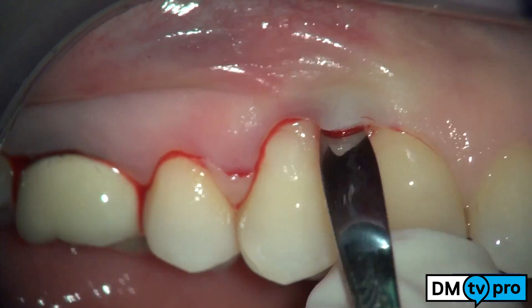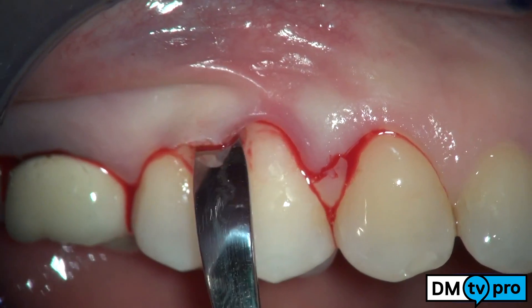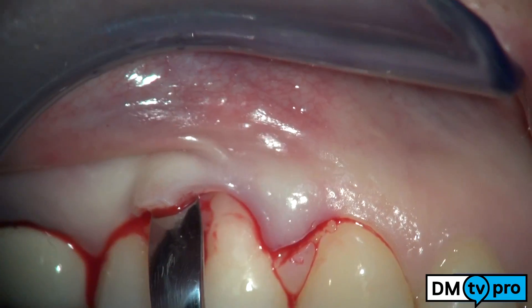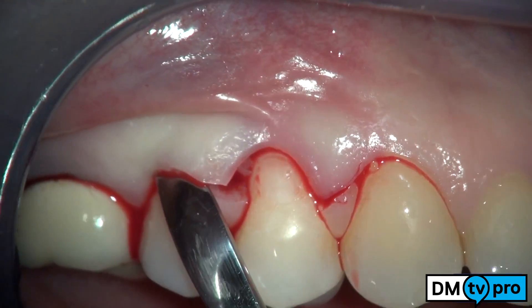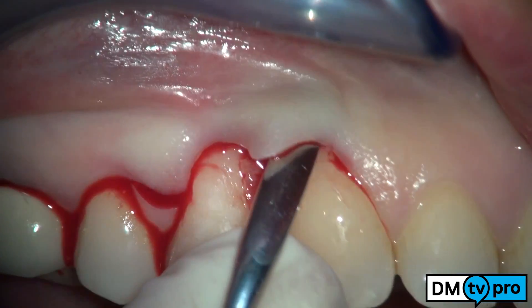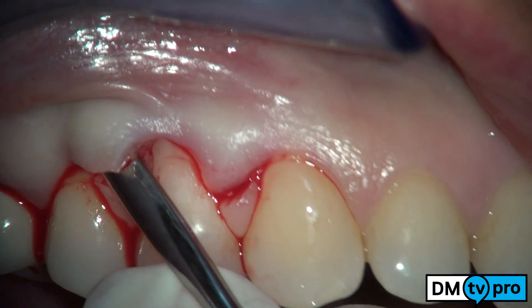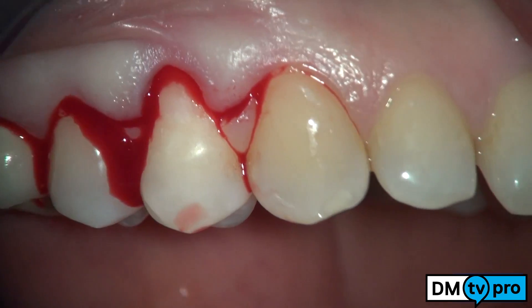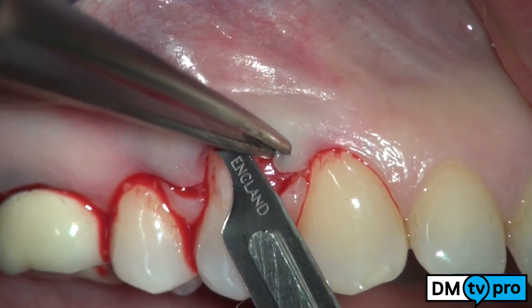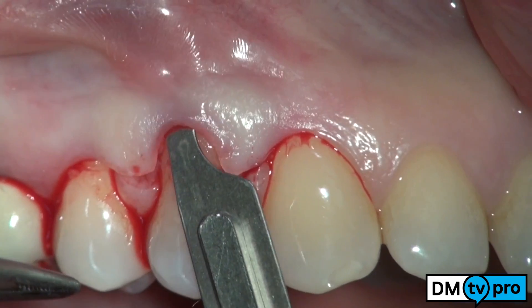The papillae and the entire amount of keratinized tissue undergo a full thickness elevation extending in an apical direction almost 2 mm beyond the mucogingival junction. Then, a split thickness dissection is performed apically to the mucogingival junction. This surgical maneuver allows a passive flap advancement.